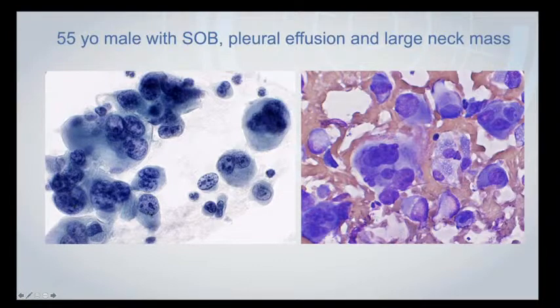Look at the chromatin texture. Look at how malignant this chromatin is. Big, big clumps of chromatin, uneven distribution of chromatin, clearly aneuploid, multinucleated. Here with the Romanowski stain, this one looks like a bizarre form of a megakaryocyte, if you will. Here for size comparison are some macrophages in the image on the right.